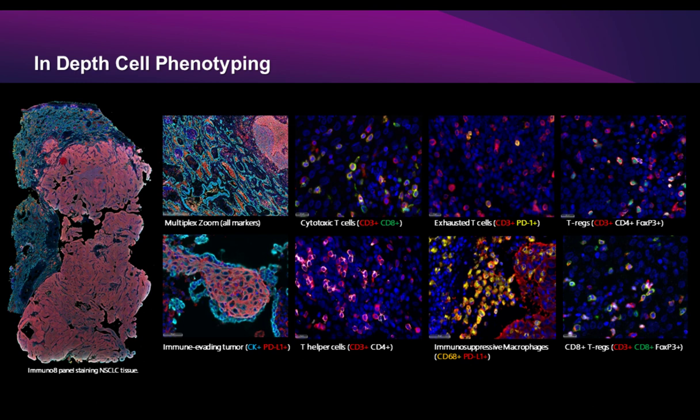So I can take that question. So we don't use secondary antibodies. We actually use the DNA barcodes, amplify those, and then come in with complementary imaging strands conjugated to fluorophores to actually detect those primary antibodies that are laid down. And since we're not using secondaries and we're using those barcode conjugates to do the detection, we can have any species of antibodies in our primary antibody cocktail. They can be sourced from mouse or rabbit. It does not matter. And then what was the second part of that question?